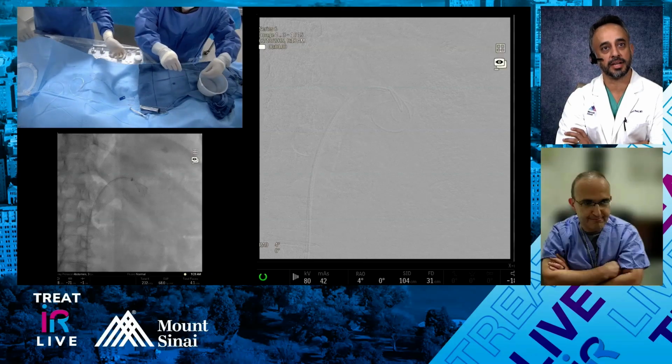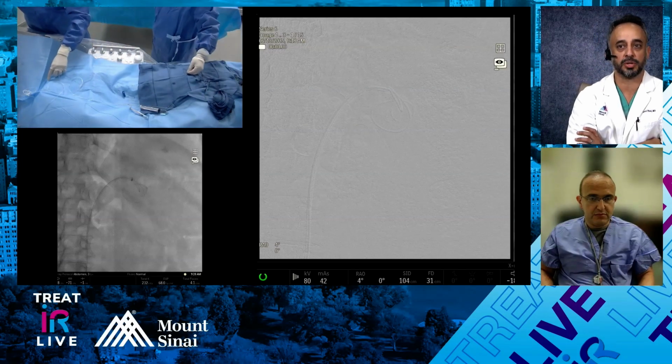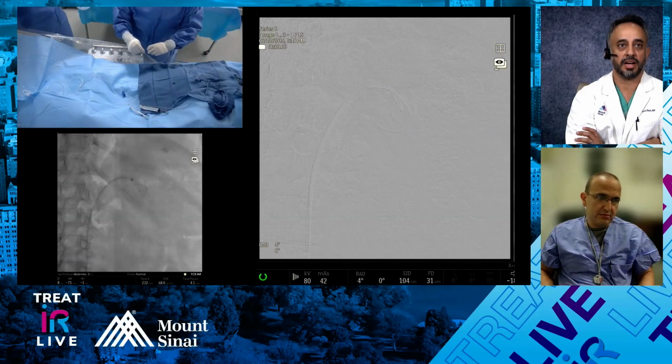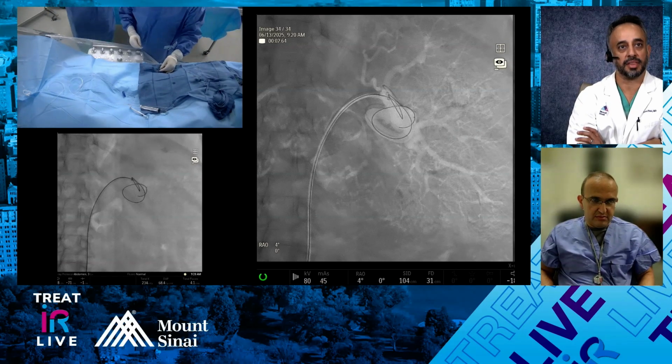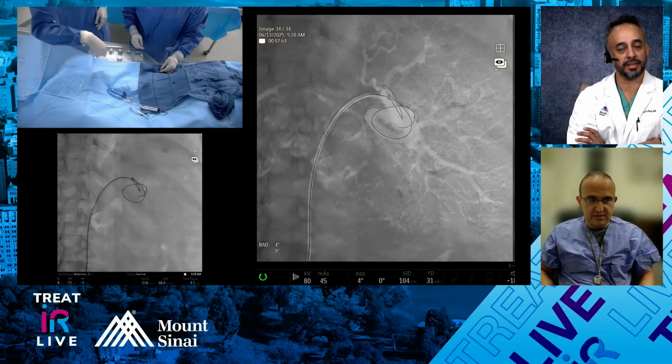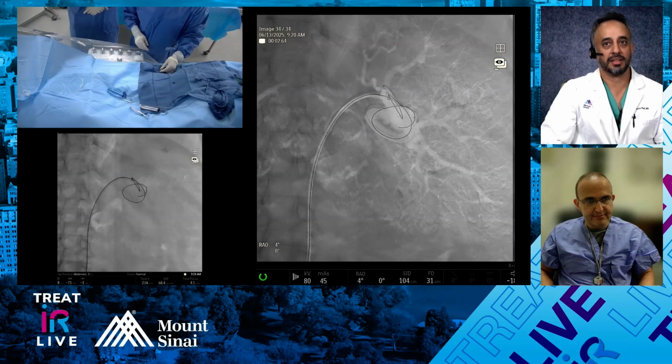There is some data, not necessarily with aneurysms, but more with vessel sacrifice, showing fibered coils being a little bit faster. I'm not really sure we have data to show that one is really better than the other. Yeah, I completely agree with you too. Thanks for that added commentary, Emil.